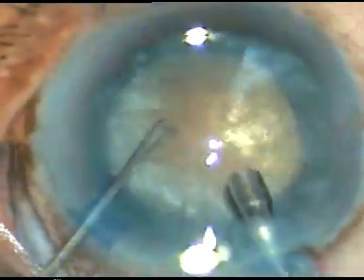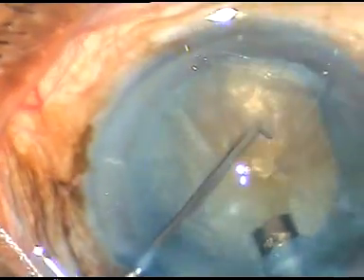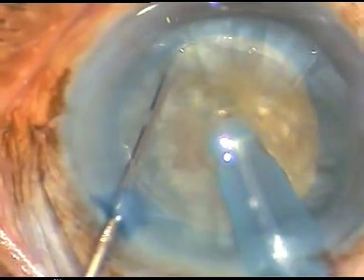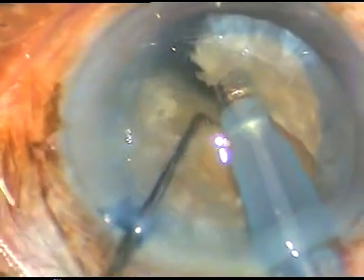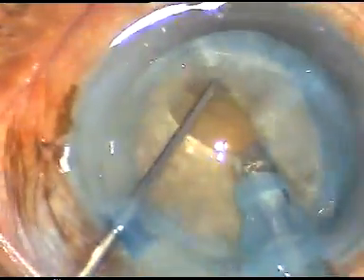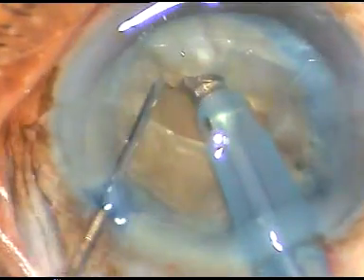Now these cataracts are usually hard and nuclear sclerosis is about grade 4 or grade 4 plus. So what I do in this case is I do the wood cutter's technique. Wood cutter's technique is you go from the equator just underneath the main incision towards the opposite equator and just do a horizontal chop.